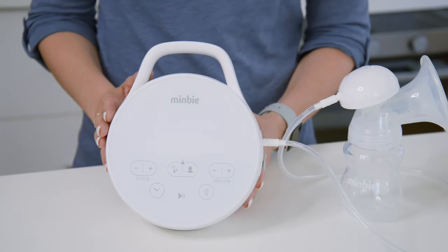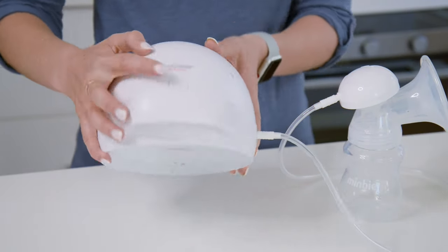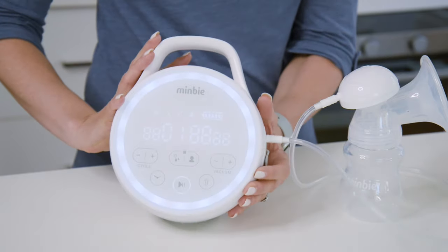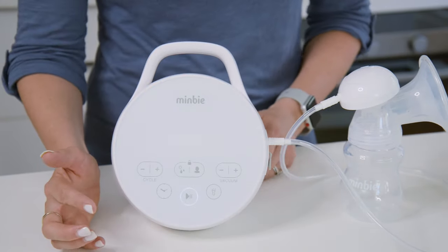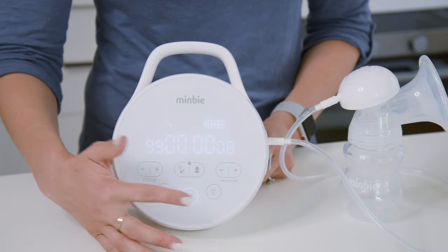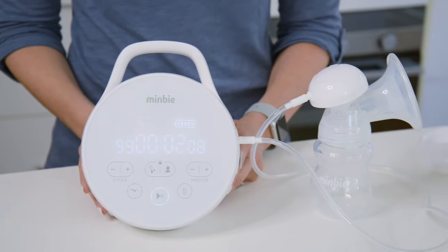Now I'm going to show you how to use the Mimbi breast pump. If we just turn it, you'll see the on and off button — push the button. On the front there is a play and pause. Lightly push the play and pause button and then it's ready to go.